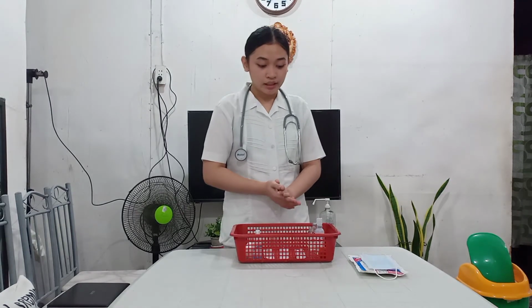We will be placing the equipment in a medication tray to make it more convenient for us to carry the medication. And also, we have here sterile gloves and a face mask to protect ourselves and the patient from possible transmission of microorganisms.